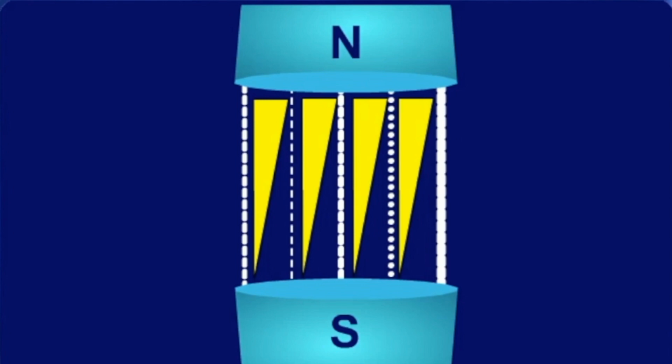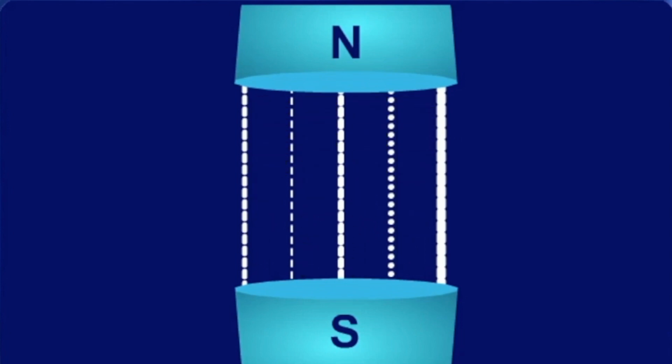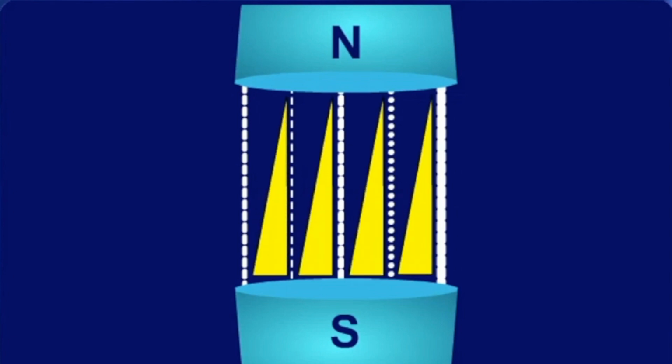Protons dephase faster. Then the magnetic gradient is switched off, and after a short time turned back on with the same strength, but in the opposite direction. The faster-moving protons now become the ones that move more slowly, and vice versa, similar to what happens after a 180-degree pulse. This results in some rephasing, and thus the signal increases again to a certain maximum, which is called a gradient echo. After this echo, the signal decreases again.